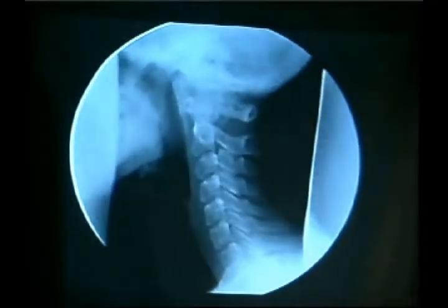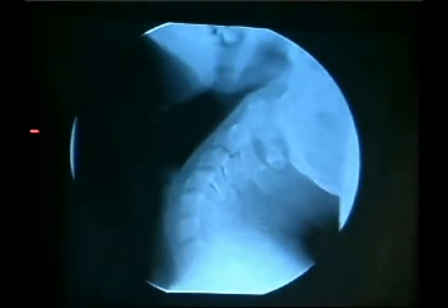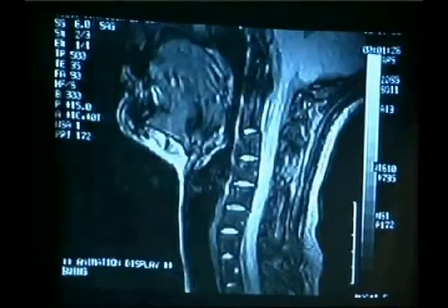So I just want to show this is not what we do. So don't talk to your insurance company saying we're doing video fluoroscopy. This is what they think of video fluoroscopy. They don't respect this because you can't diagnose.